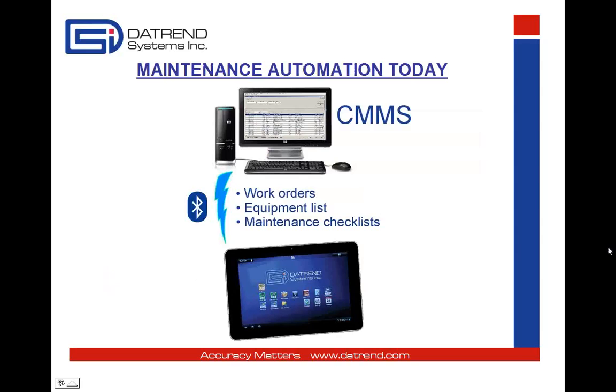This new technology relies on piggybacking on existing CMMS infrastructure, the med tester system, while at the same time expanding its capability with a mobile computing device, such as a tablet. It's similar in principle to a med tester, but it's more advanced. Exactly how it works is going to depend on the CMMS that's in use. So here's the first situation.